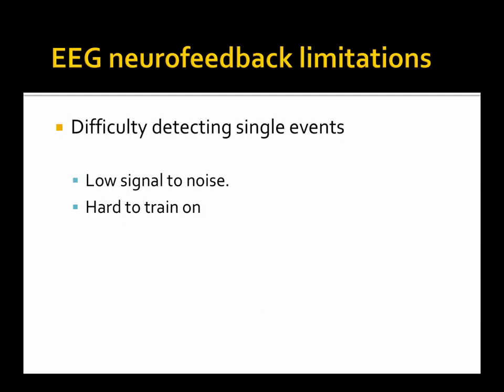So as I mentioned before, the difficulty in these is that the signals are quite noisy. The signals that I showed you before are an average over a large number of events. In fMRI, if we have 20 events to do an average, it seems like a good number. In EEG, you go to much, much higher.